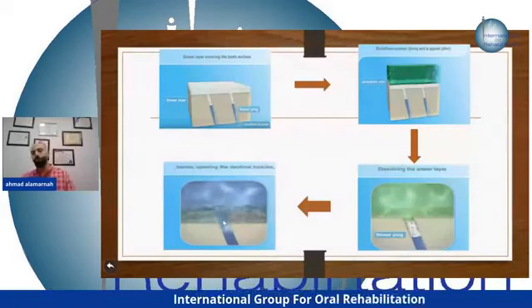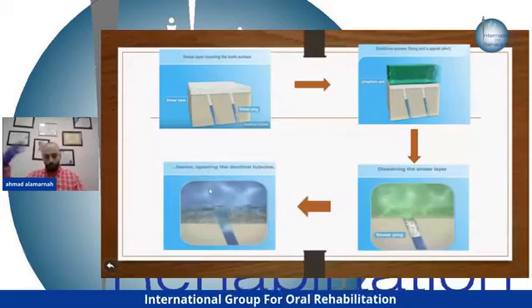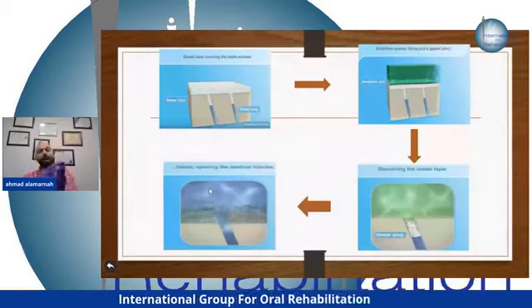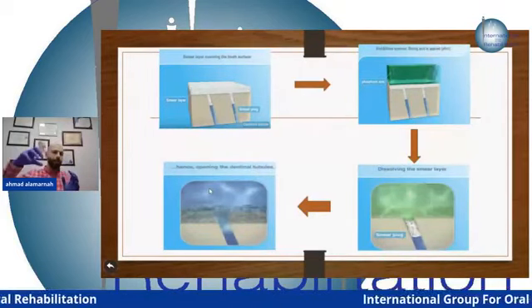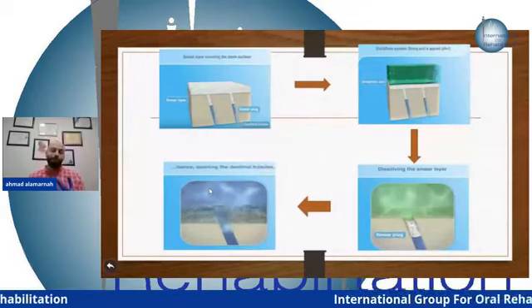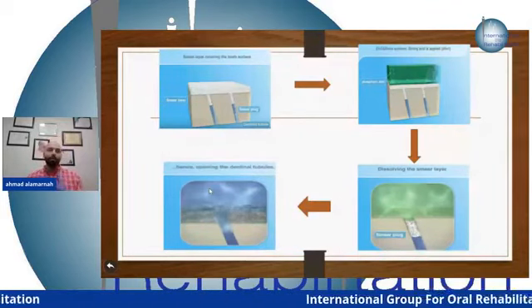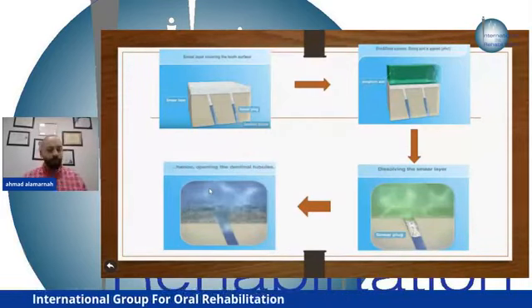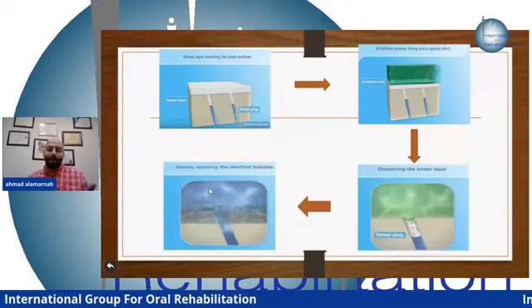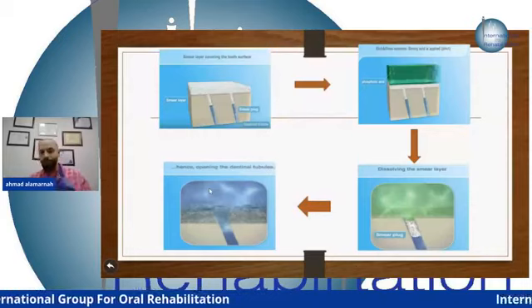for the dentin, okay? Another thing, the dentinal tubule fluid will leak into the bonding layer that we will have later on, and cause something called nano leakage. We all know about micro leakage. There is a different term called nano leakage. The micro leakage happens on the enamel or on the margins of the restoration, the outer margin of our restoration. But what is the nano leakage caused by? It is caused by the leakage of fluids from the dentinal tubules, after you remove everything, the smear plug, okay, and will cause a degradation of the hybrid zone, of the hybrid layer, okay? This degradation will cause nano leakage and pain within 1 week after the restoration, okay? The nano leakage and the micro leakage. You have to know the difference between the nano leakage and the micro leakage.